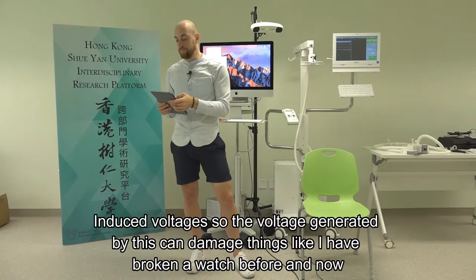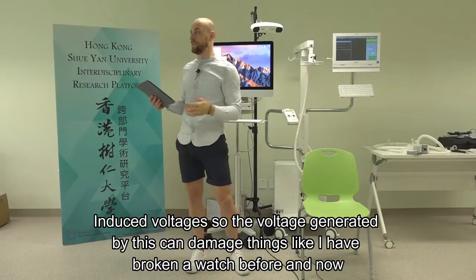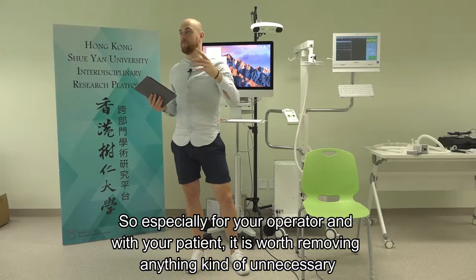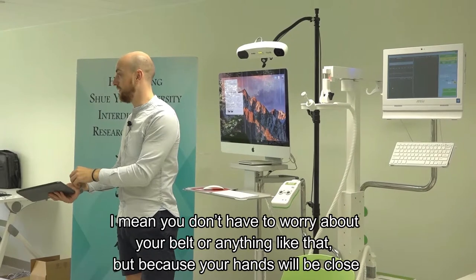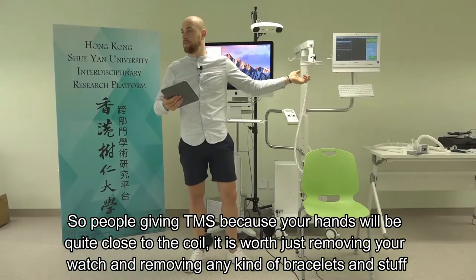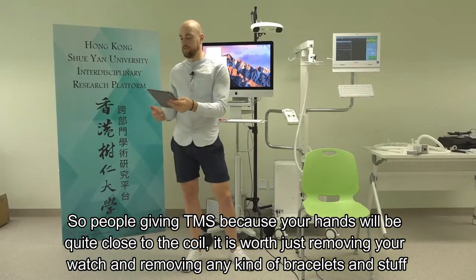Induced voltages - the voltage generated by TMS can damage things. I've broken a watch before now. For your operator and your patient, it's worth removing anything close to the coil. You don't need to worry about your belt, but because your hands will be quite close to the coil when giving TMS, it is worth removing your watch and any bracelets.